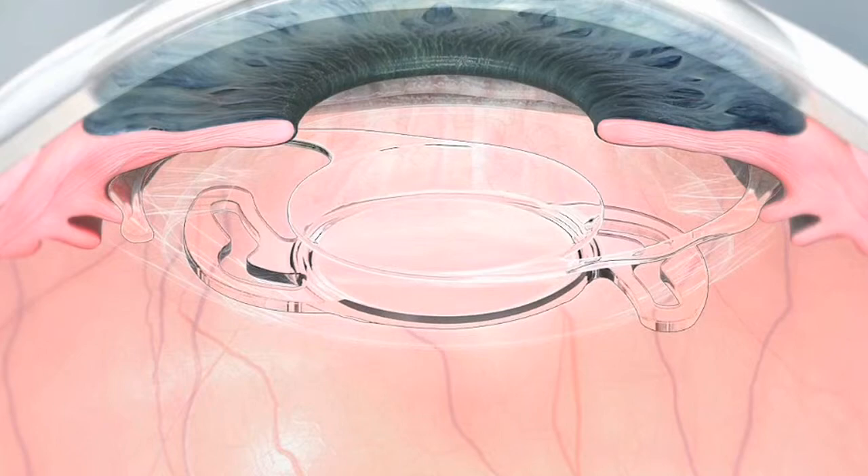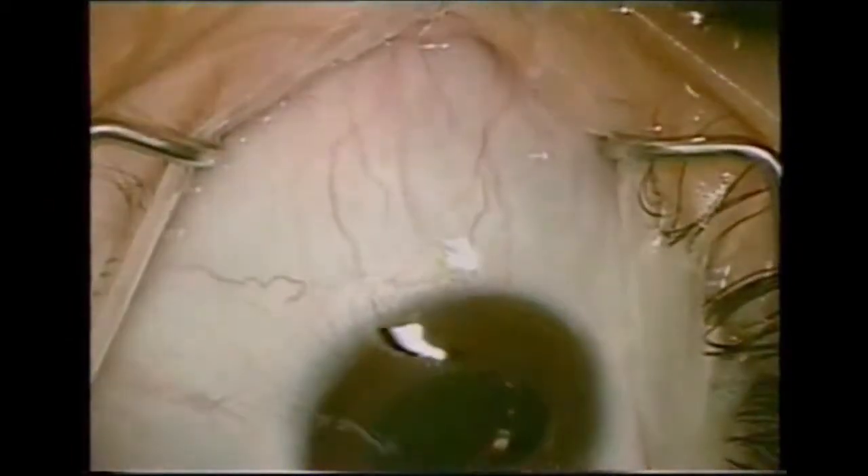The lens has a concave posterior surface that precludes contact between the two materials. The particular benefit of a sulcoflex lens is that the procedure is reversible. So if you correct ametropia, post-op surprises, biometrical surprises, or whatsoever, you have the chance to change the situation. You can explant that lens easily.